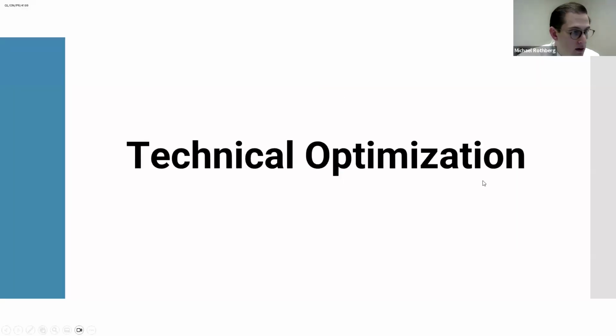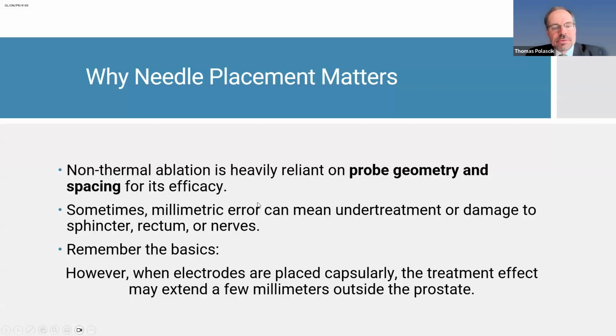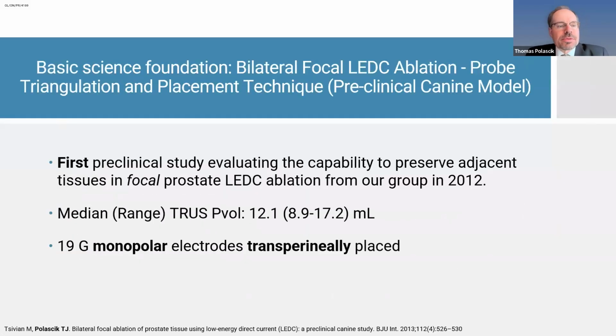Okay, thank you. So I have the great pleasure of working with AngioDynamics really from many, many years ago when we did some of the first studies. This is at a time when the NanoKnife first came into being, and we were working in the lab with animals. Next slide, please. So I just want to give a little historical background.